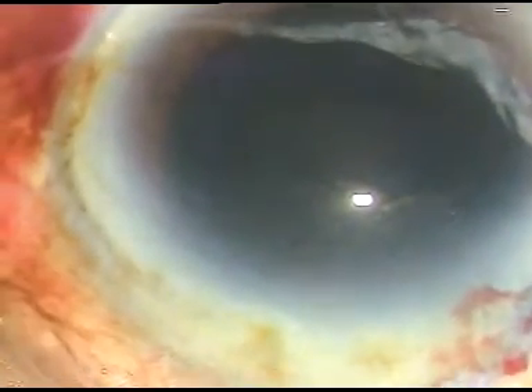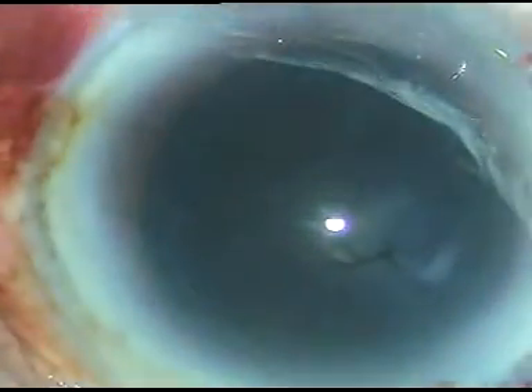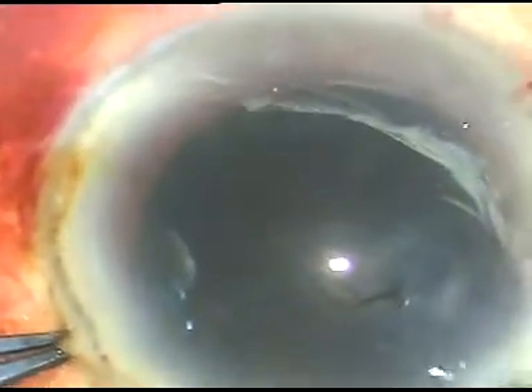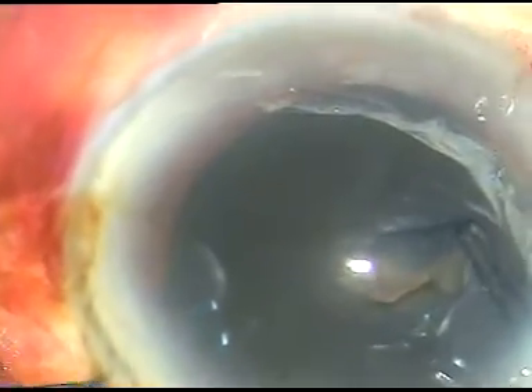I hold this flap with the Utrata forceps. The forceps rests against the anterior lip of the main incision, pressing against it so that leakage of viscoelastic substance becomes very minimal.